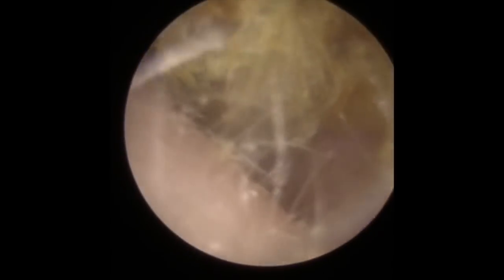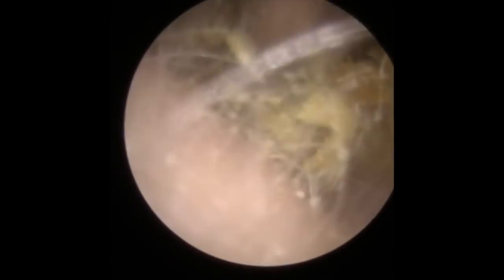I'm trying to lift it off the base of the canal because it's really stuck here. You can see a little bit more movement to the wax now. There's a little bit of dry skin down there as well which has been holding this in. Trying to manoeuvre that dry skin out, but now we've unstuck it, let's try and get behind it with the Jobson and break a little bit more away.